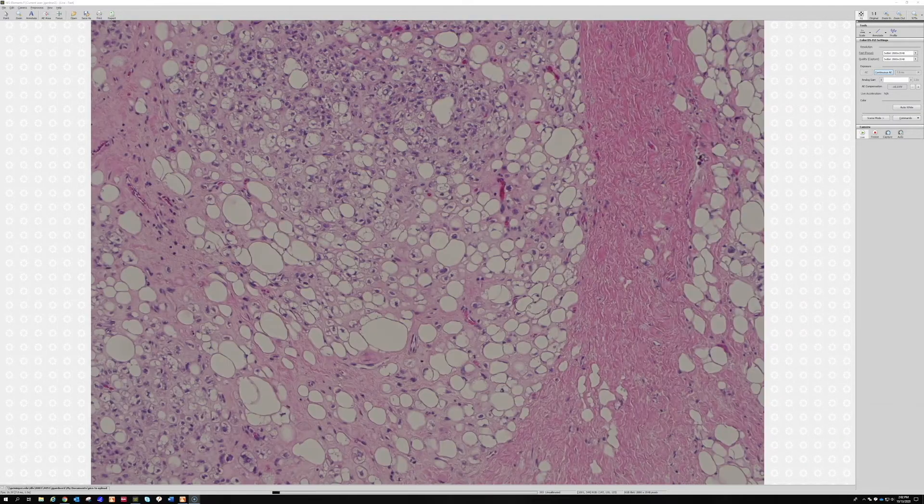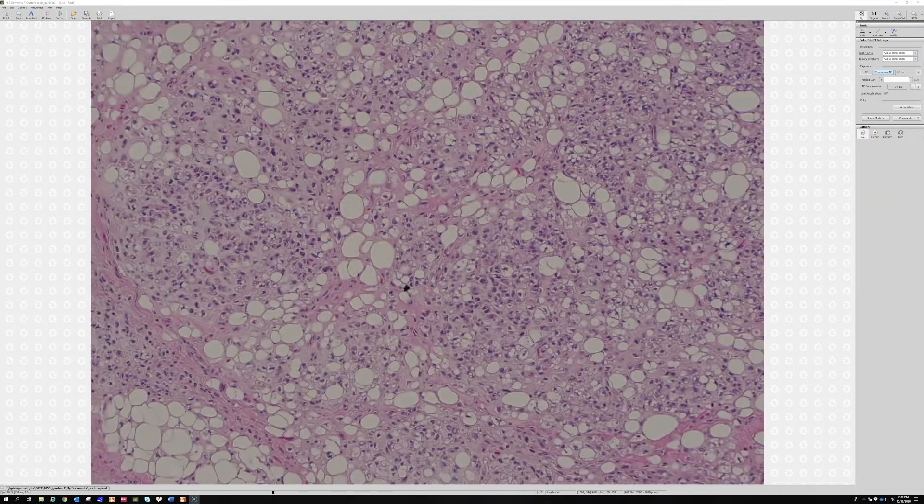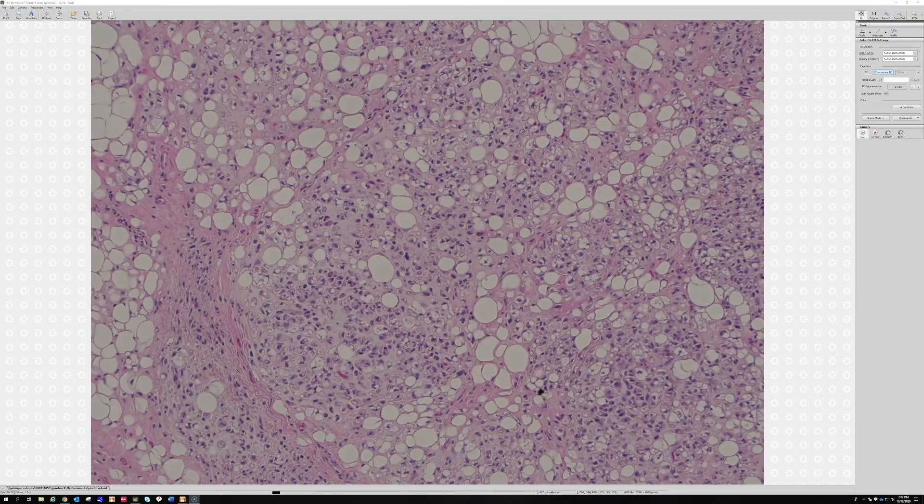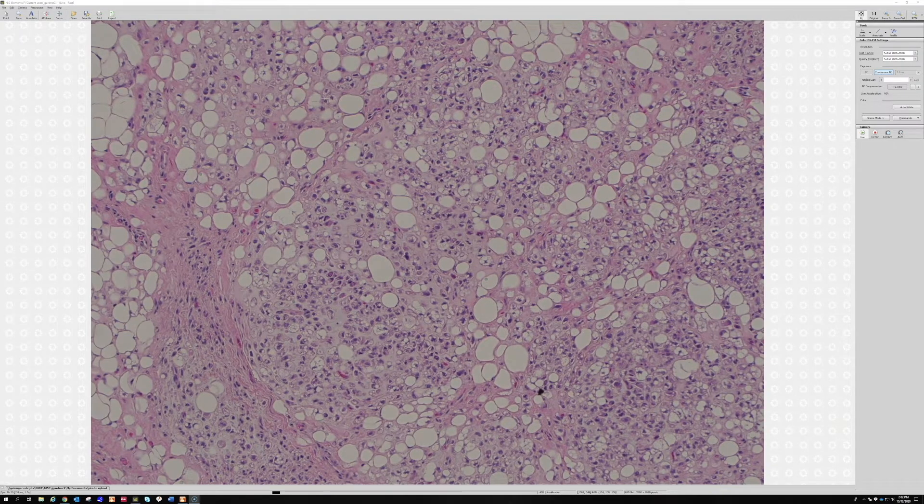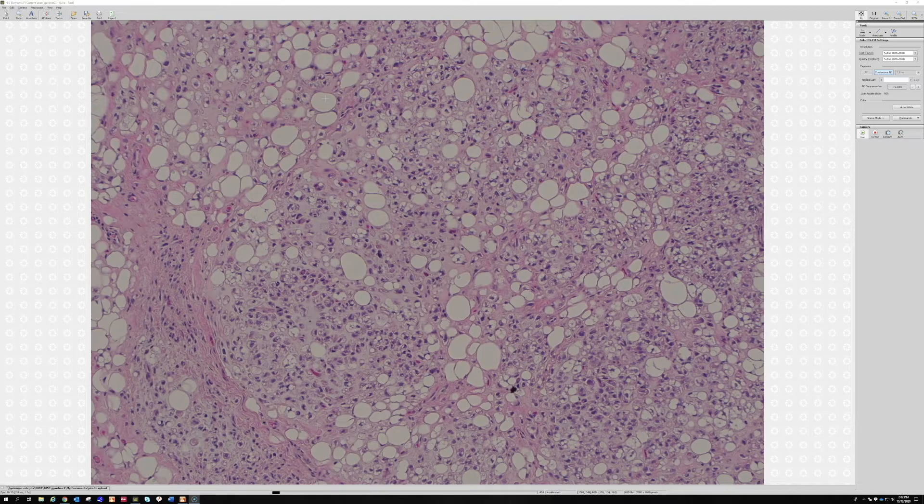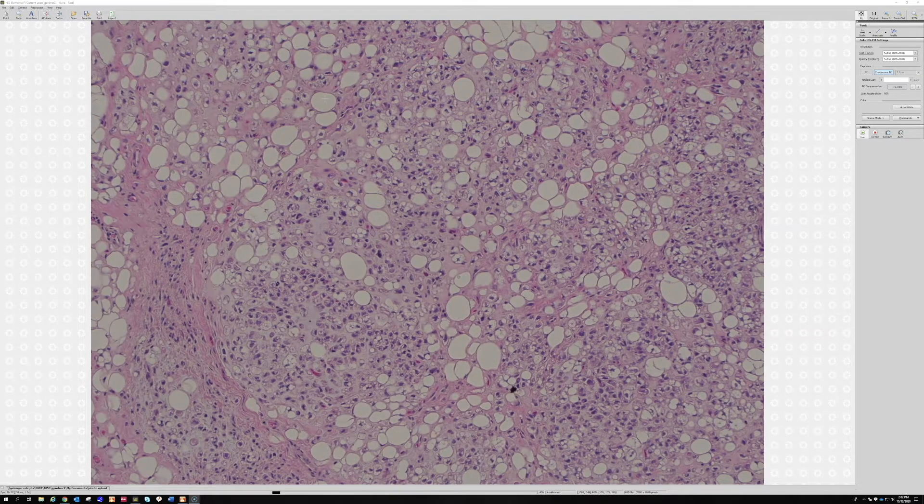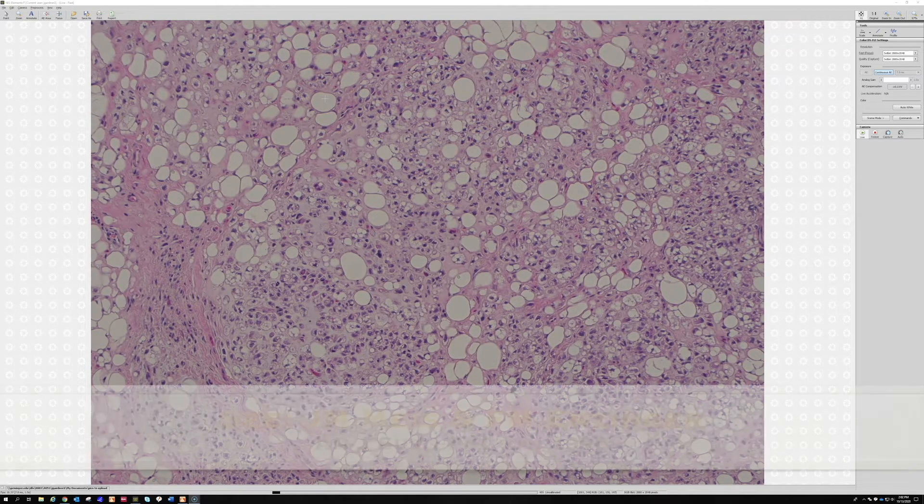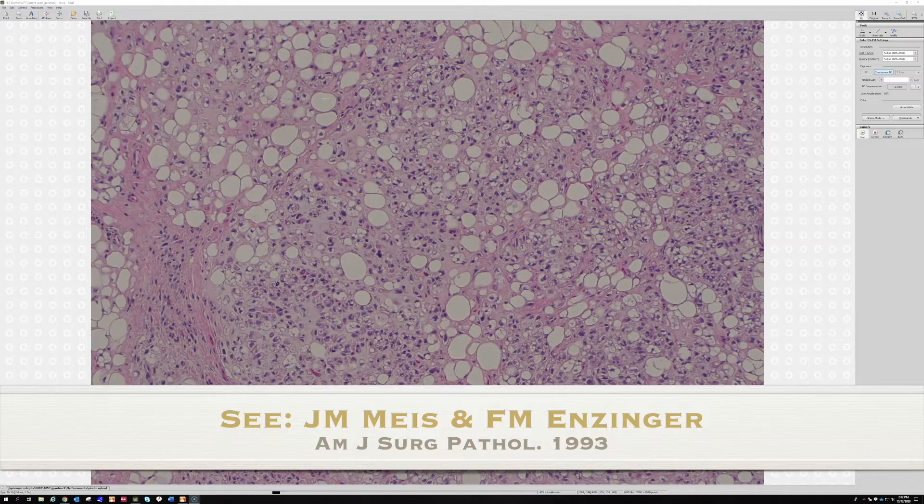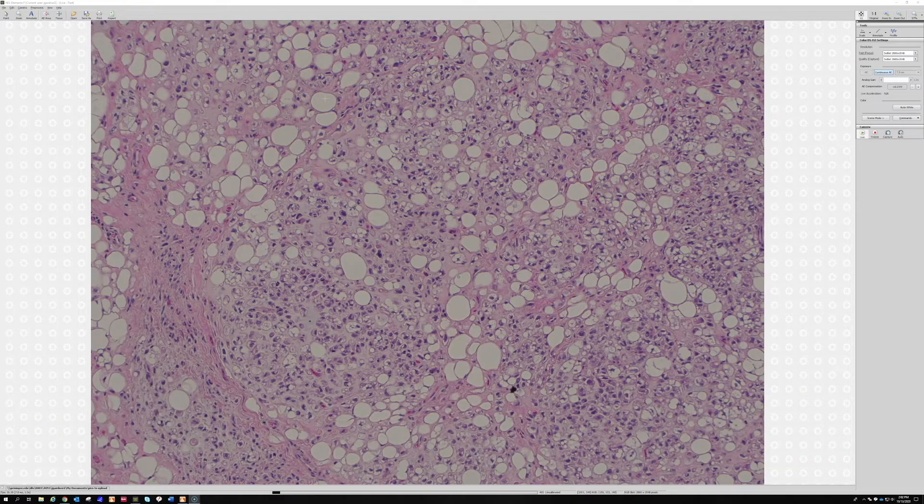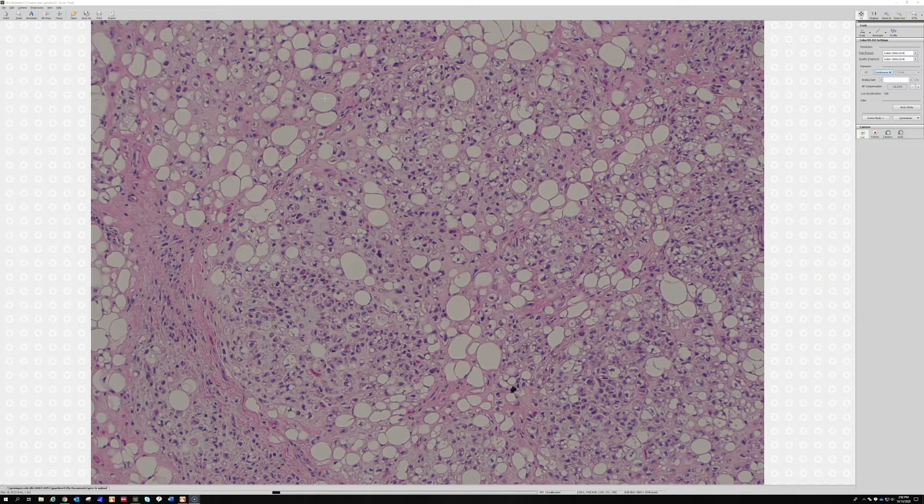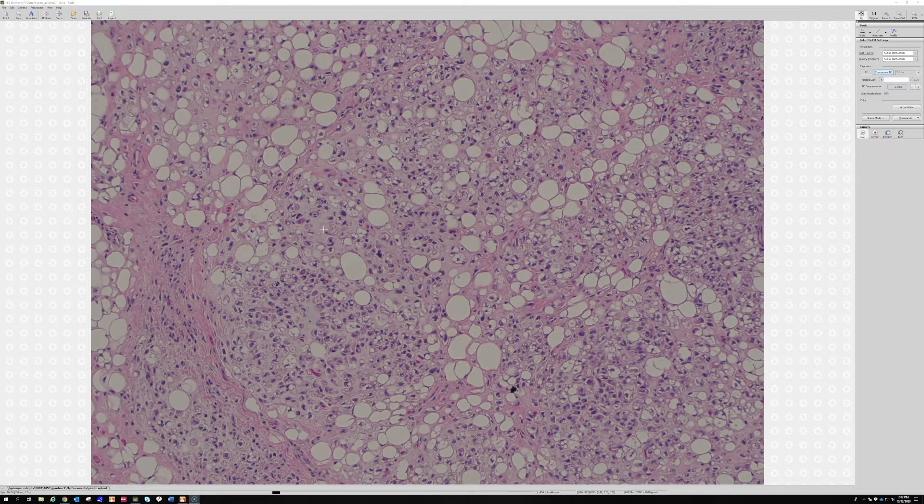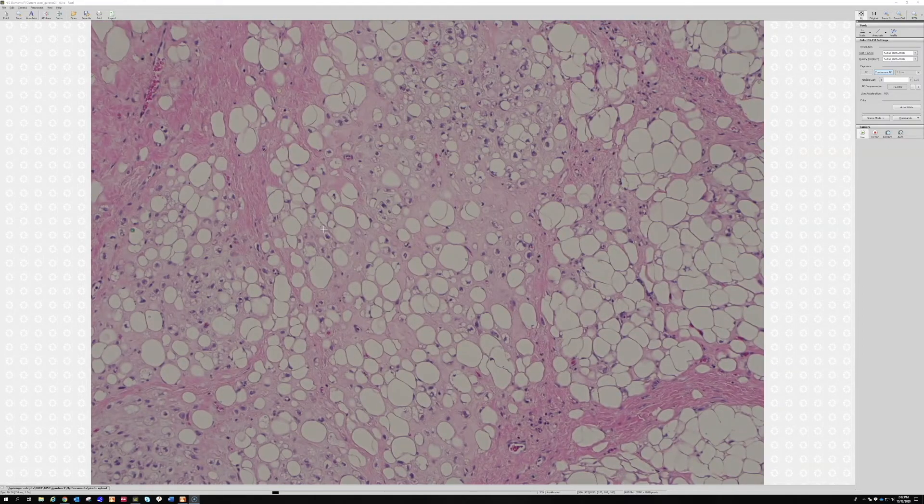I like that you pointed out you have to hallucinate, because I totally agree. Even though the name—I believe it was actually named by Franz Enzinger, who trained Sharon Weiss, who trained me—even though he named it and named a lot of very important soft tissue tumors, the small handful of these I've seen are supposed to look chondroid, but they don't look super cartilaginous to me. They don't really look like real cartilage, but they've got that kind of bluish chondromyxoid background and the cells kind of individually sit in their individual spaces like lacunae.